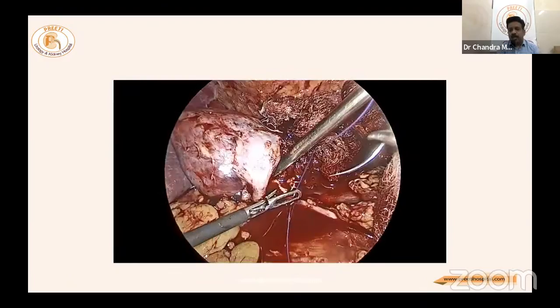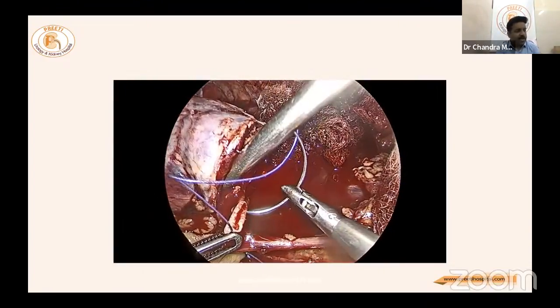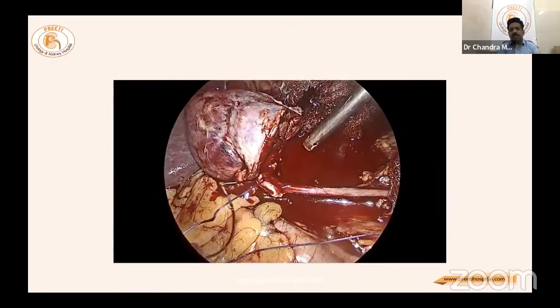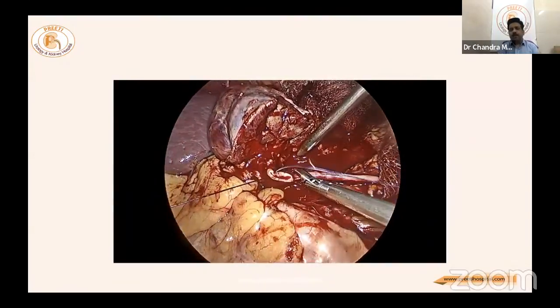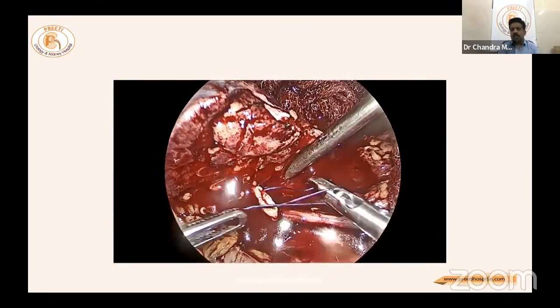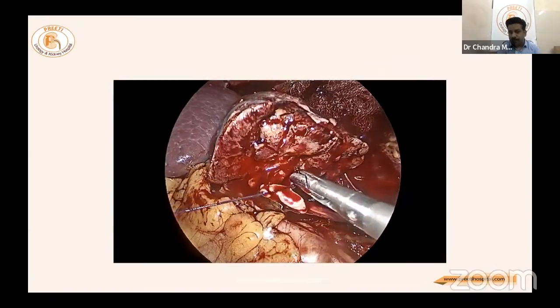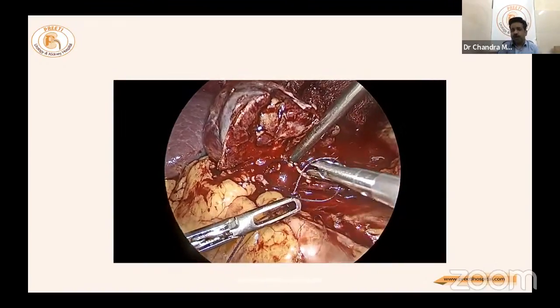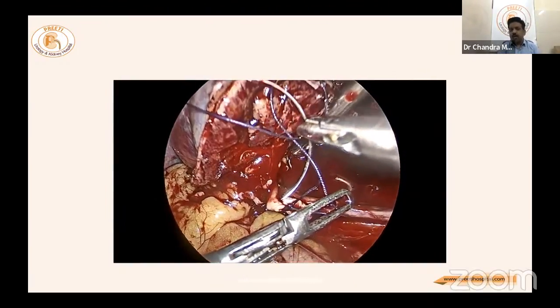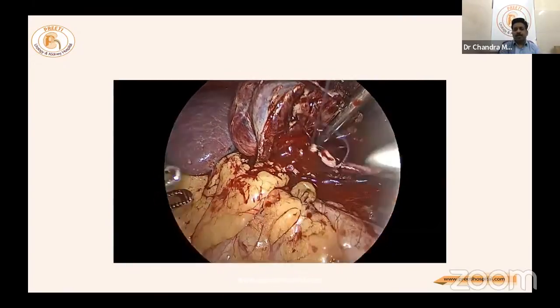The lower pole infundibulum is now clearly visible — the clip could not be applied, so the pelvis infundibulum is sutured carefully. If a deep bite is taken, the entire pelvis will be closed — that is why ureteric catheter insertion is very useful in hemi nephrectomy. This large lower pole infundibulum had a clip only half-placed, requiring suture repair.